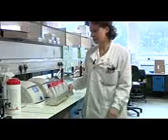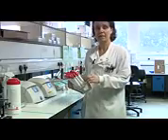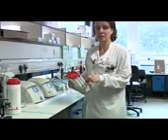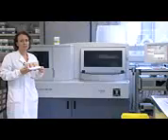This is our rapid MRSA screening bench where patients' nose swabs are screened to see if they carry MRSA. The detection method used is a PCR method, which is a polymerase chain reaction method, looking for the genetic material of MRSA. This laboratory does the testing for the sexually transmitted infections chlamydia and gonorrhea. Chlamydia is the most common sexually transmitted infection.